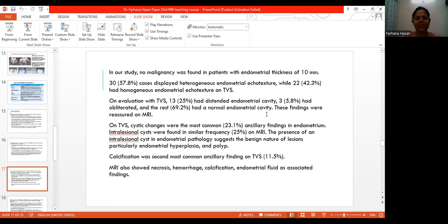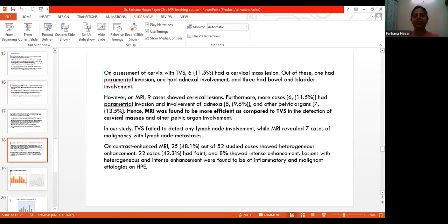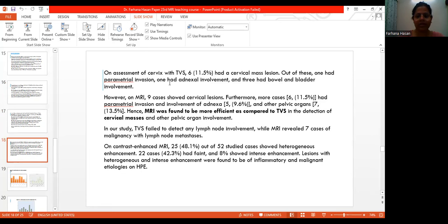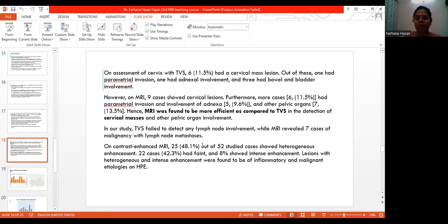On TVS, cystic changes were the most common ancillary finding in endometrial lesions. Intralesional cysts were found in similar frequency on MRI. The presence of an intralesional cyst in endometrial pathology suggests the benign nature of lesions, particularly endometrial hyperplasia and polyp. Calcification was the second most common ancillary finding on TVS, and MRI showed necrosis, hemorrhage, calcification, and endometrial fluid as associated findings. On examination of the cervix with TVS, only 6 had a cervical mass, with 1 showing parametrial invasion, 1 with adnexal involvement, and 3 with bowel-bladder involvement. However, MRI showed 9 cases with cervical lesions, about 6 with parametrial invasion, 5 with adnexal involvement, and 7 with pelvic organ involvement. MRI was more efficient than TVS in detection of cervical masses and pelvic organ involvement, and also detected lymph node metastasis where TVS failed.